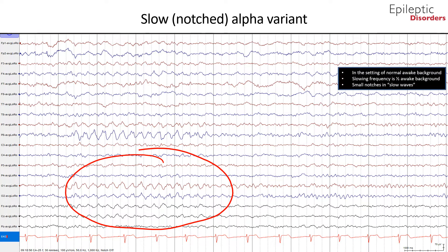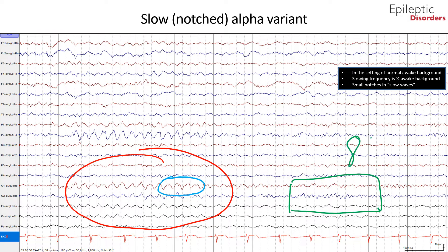Additionally noted are the small and subtle notches as outlined by the blue circle. This patient's normal background appears to be 8 Hz as outlined in the green box, and thus the slow variant is half that of the normal background.